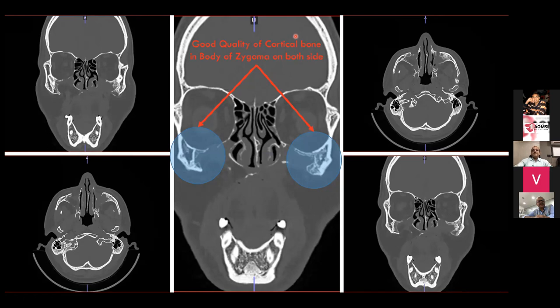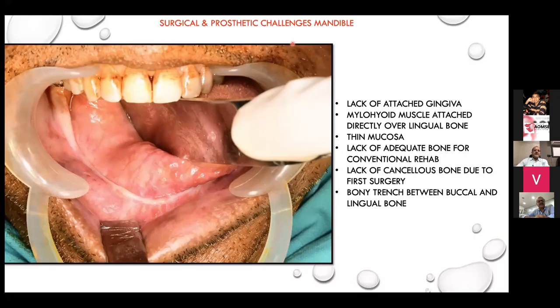So where is the problem in converting that to a clinical scenario? It is soft tissue consideration, because when we plan the patient-specific implant, instead of planning according to bone, you have to plan according to soft tissue. You have to see the soft tissue cover first, then you plan the patient's implant, so that in the long run you don't get any soft tissue problem. Most of the time, when you fix the implant, the soft tissue gives up over a period of time. That is because the implant design is not compatible with, or not in consideration of, the soft tissue.